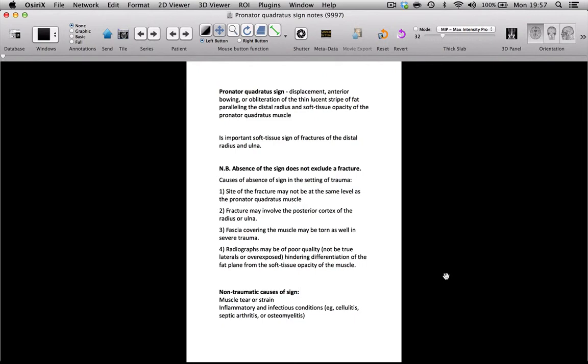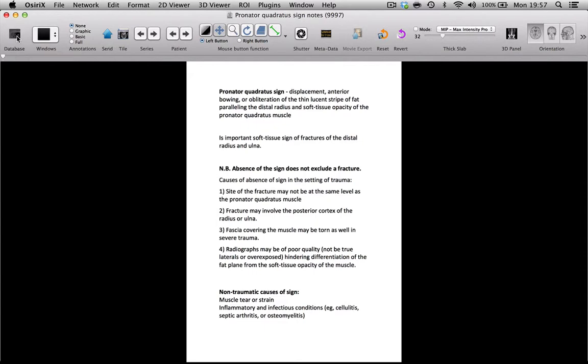And that's, again, quite useful when you're teaching if you want to have a quick reminder of the differential diagnosis and not lose face in front of your trainees.